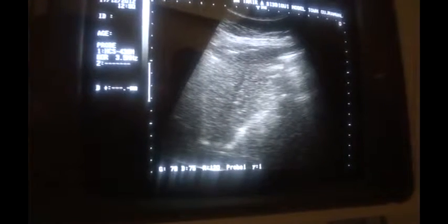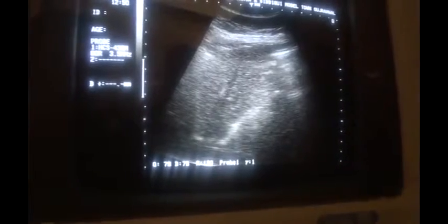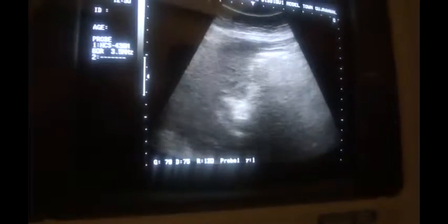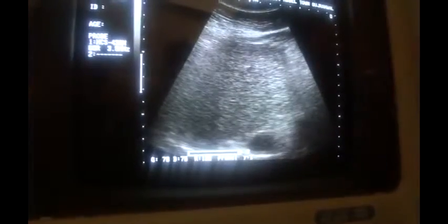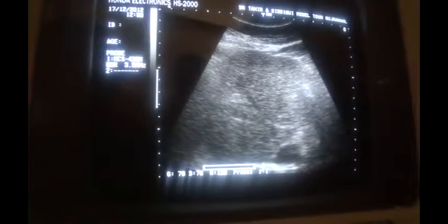and this is the left lobe of the liver in longitudinal section, showing you irregular outer surface as well as coarseness, blurred margins of the vessels. This is a cirrhotic liver, and you can see the difference between the normal and this one, this segment.